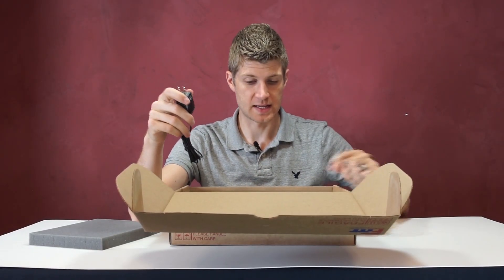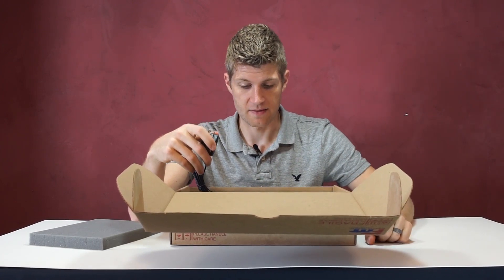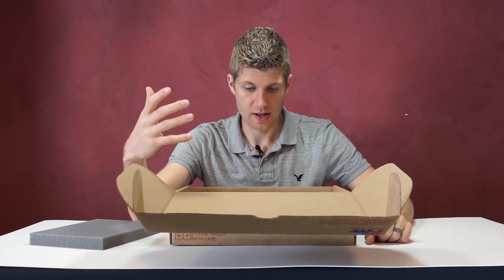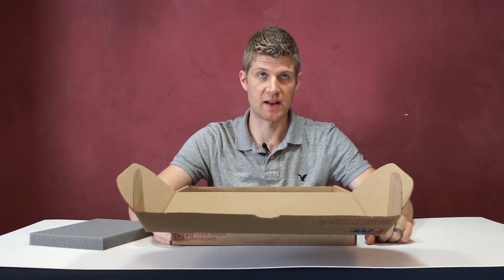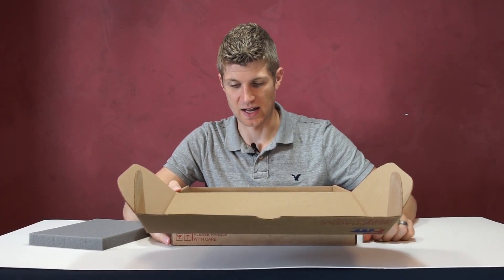An important thing to remember is that the iPad and the structure scanner both have a battery, so each needs to be plugged in and charged every night. The battery should last about a week, but we say charge them nightly just to be safe so you don't have a dead battery when it comes time to scan a patient.